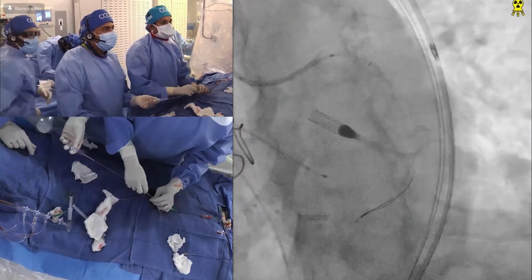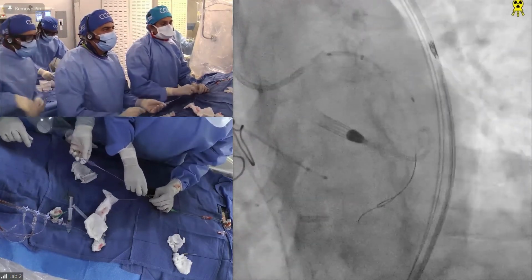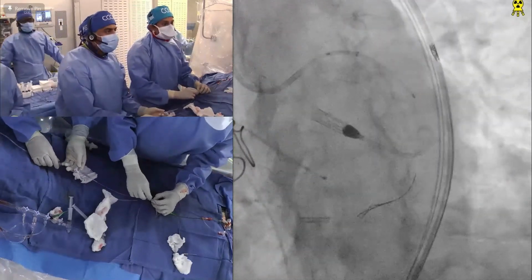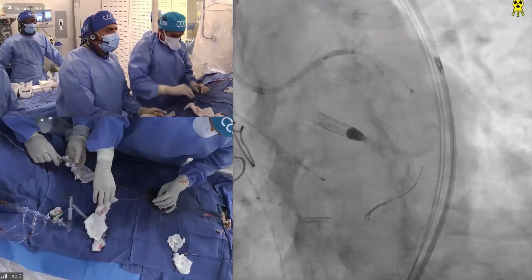Because I think we agree, we need to go through this step by step. Yeah, everyone wants the techniques, one step by step. Yeah, exactly. And they want to see the case in its entirety. That is the key. Watching this struggle, so we just have 2 cases. Yeah.